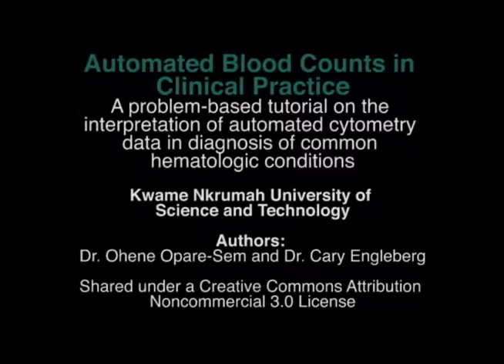The automated counter would examine thousands of cells, but then translate that information into statistical data that are very, very useful to unraveling pathology. Nowadays, almost all the regional hospitals have automated blood cell counters. That's how available they are in the world at large. And yet, the understanding of their results lags behind their availability.